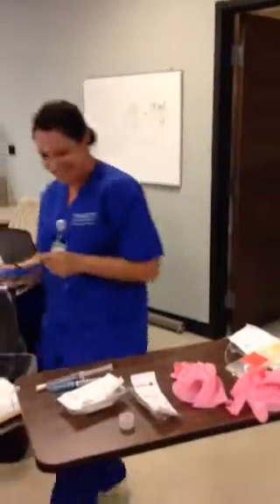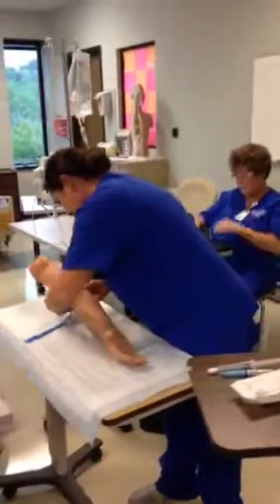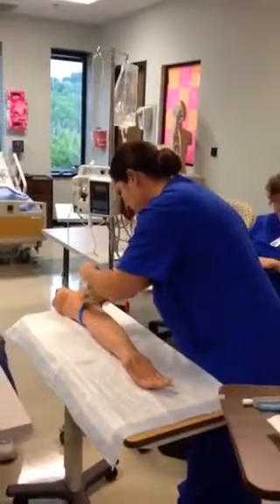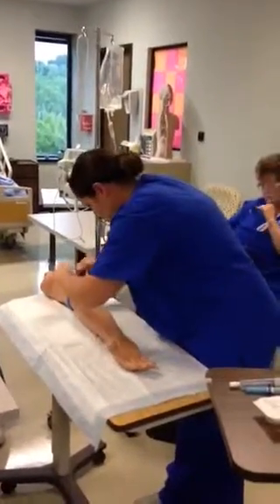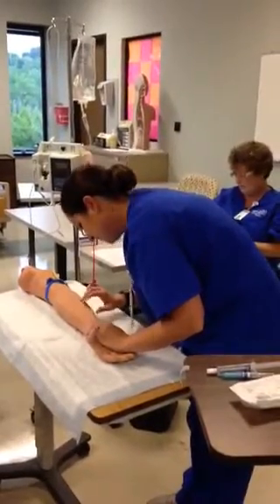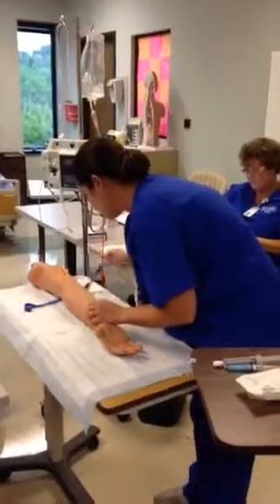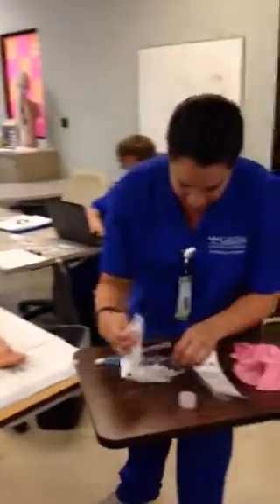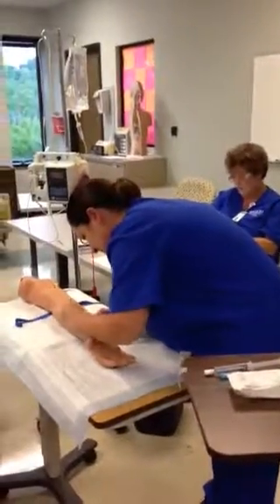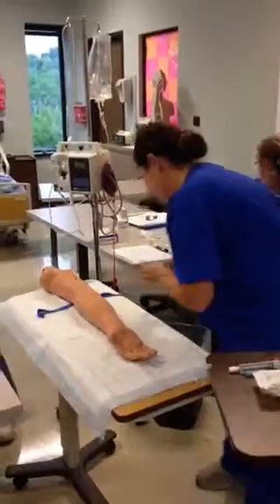I'm back. All right. Let's see. I'm going to put this tight band around your arm. I want to look and see where a good place might be to start this line. Let me just see here. That looks great right there. Okay, get that tight band off. And I'm going to clean your skin with some skin prep here. A little bit of cold. I'll let that dry.